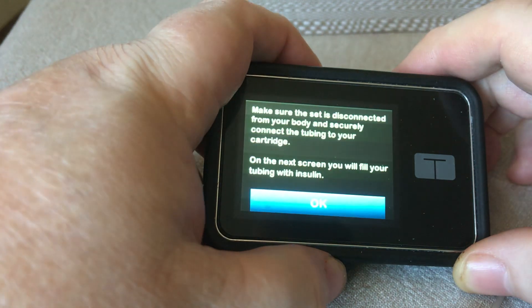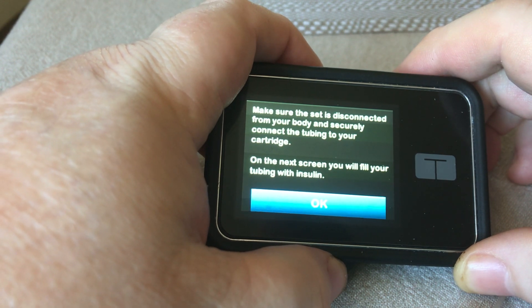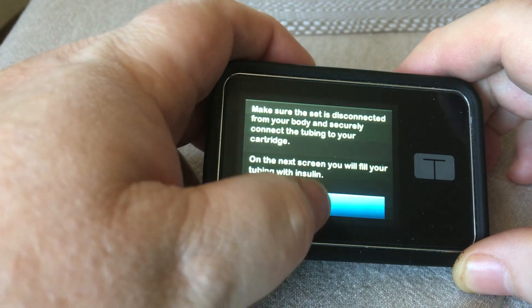Now, when you top it up, you need a minimum of 50 or 60 units — I've forgotten what the exact number is. I had 45 in there and I've added about another 30, I think. That will easily get me through till tomorrow.